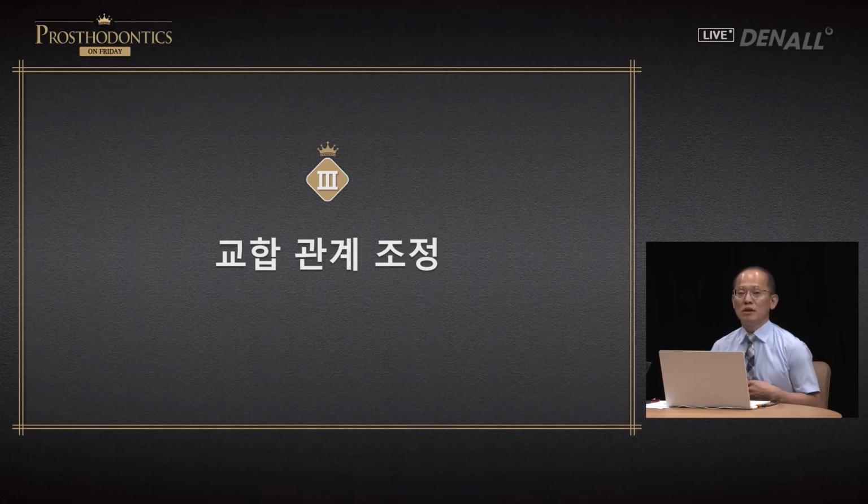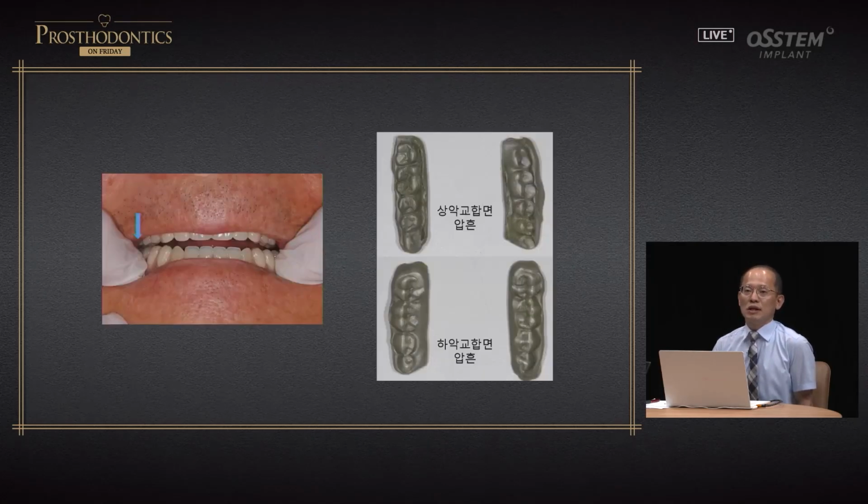So the key is, if the internal adjustment is good, then occlusal adjustment should be the final goal in your protocol. It's not about doing the adjustment very well, because the occlusal adjustment, a technician can do it for you, and for the dentist, remounting is what you need to do very well, and that's what I want to emphasize.